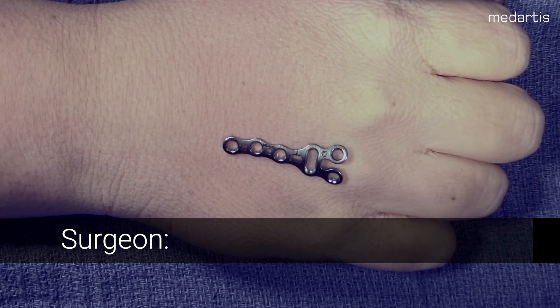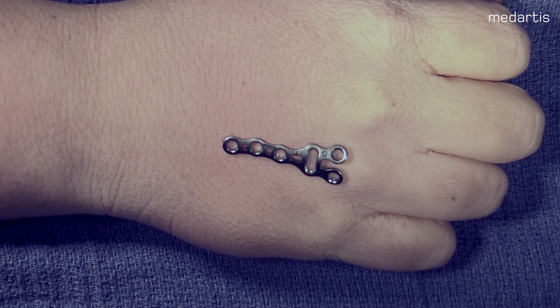Today we are going to be doing the fourth metacarpal osteotomy using the correction plate. Our plan is to offset the deformity with either a pronation or supination of the distal fragment using the rotation plate.